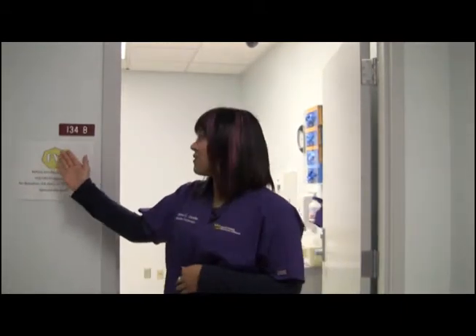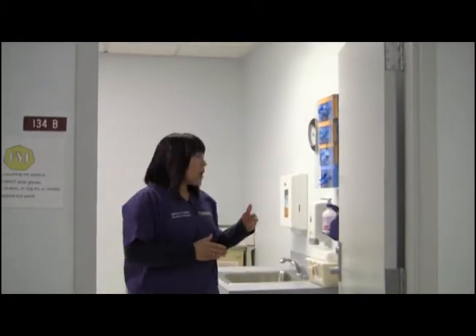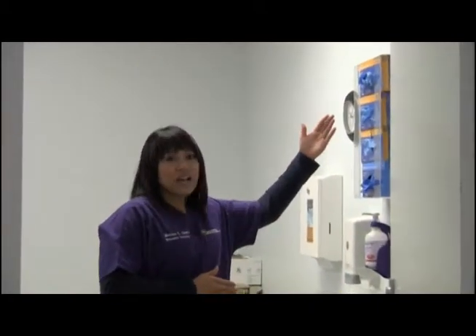Before we enter this patient room, take note you must wear gloves and that the patient is allergic to betadine and ink. Actually, the mannequin's skin can be damaged by the natural oils from our hands. Betadine and ink cannot be easily removed. The first thing that you will do when you enter the simulation patient room is to put on gloves. We have small, medium, large, and extra large.